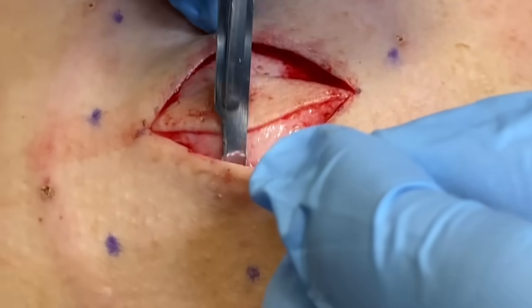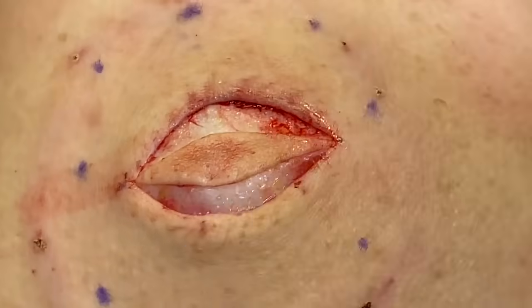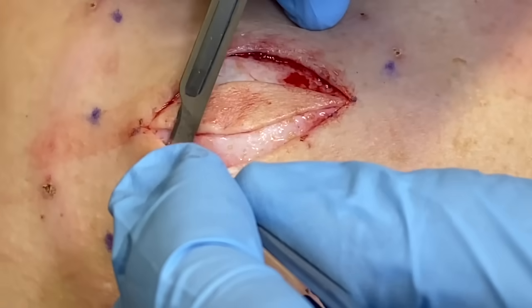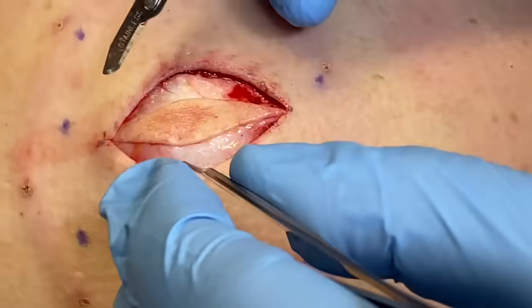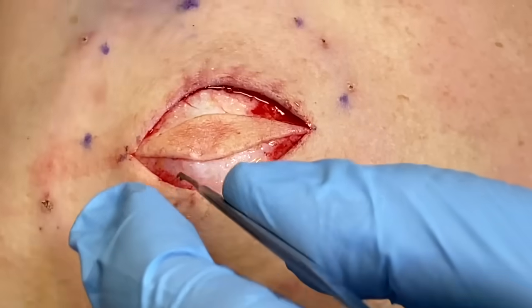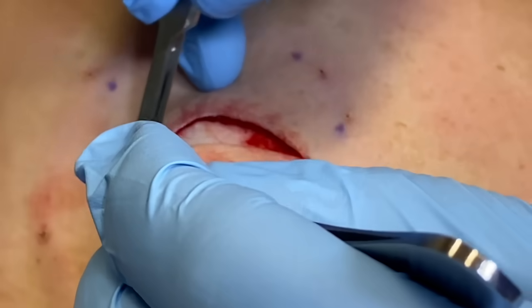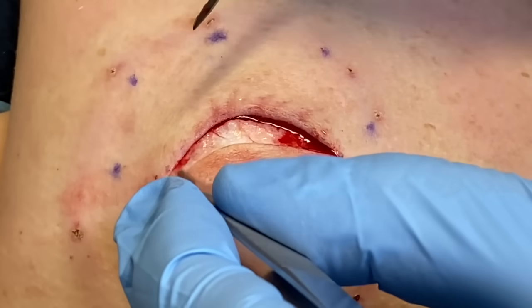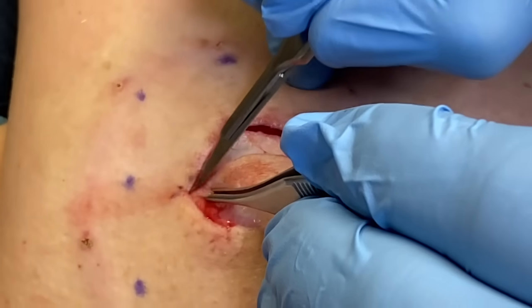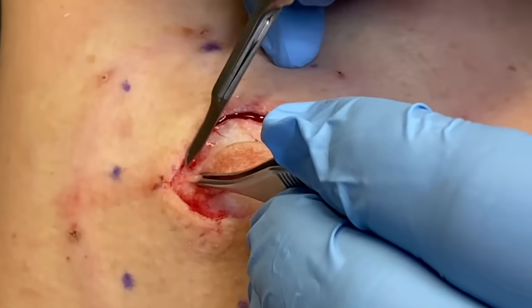Do we have the cleanse? Scissors. So I'll use the dull scissors in a second just to see if I can dissect that down a bit more. And then I'm going to do the ends. Here, I'll do the end first. So I just grab the tip and then I'll cut along that line. The retractors, yeah, thank you.